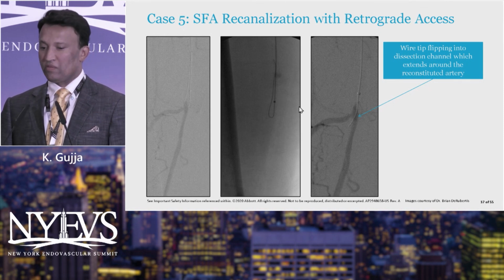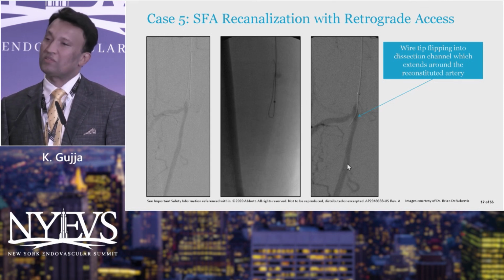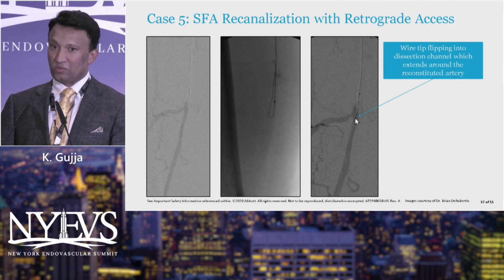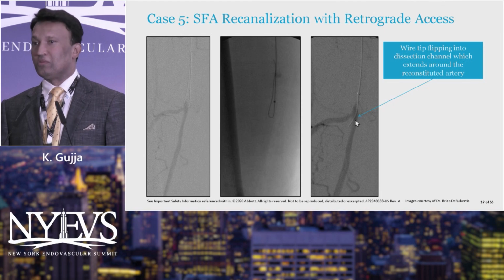So as I was just saying, if you want to recanalize, don't keep dissecting the vessel as here. That's what Dr. Krishnan was trying to say. Don't dissect through this and lose this collateral. Because by chance, if you cannot cross it, don't create a plane in which you're losing it. All right, any questions?